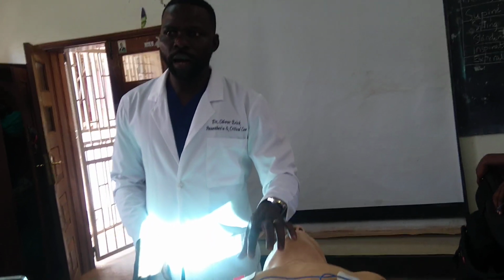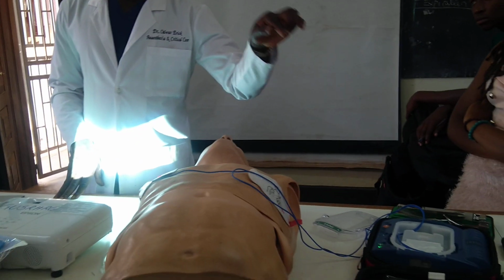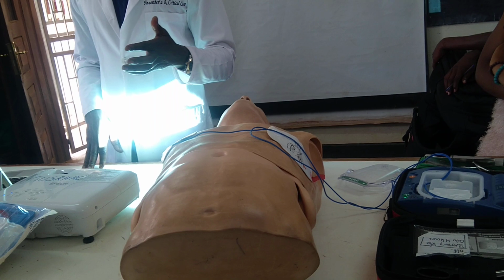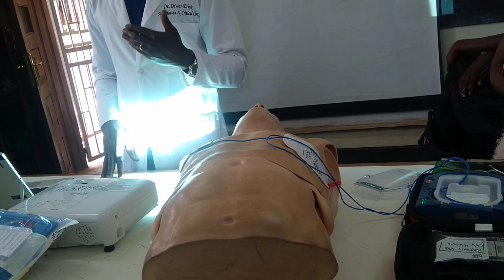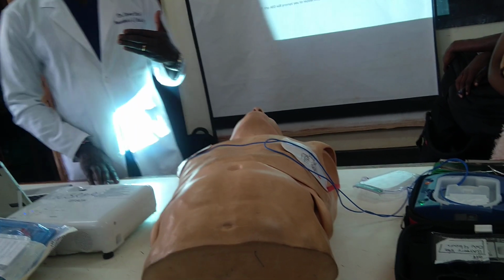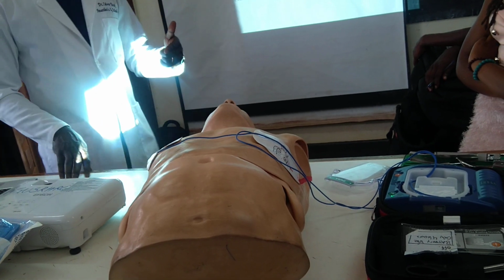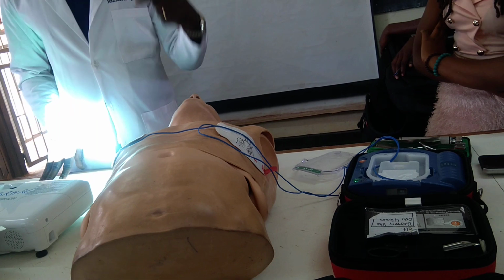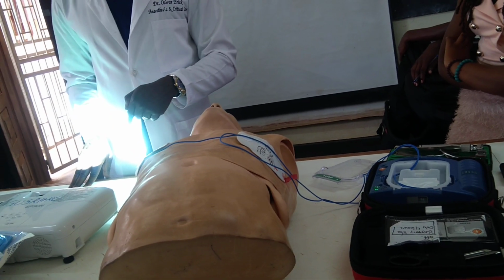By now, this machine will be... Is it okay, I can attach it to the... Yes. No, it won't shock, because if it is not shockable, it won't shock. It can only shock you when it is shockable.